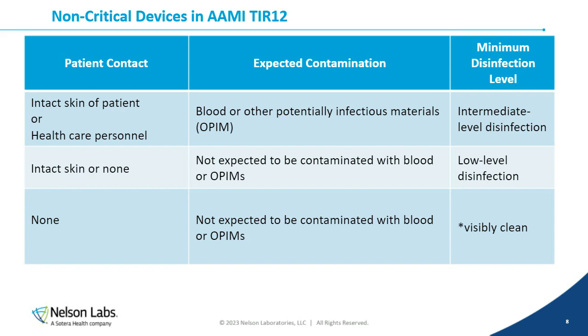That's in line with what it says in that FDA guidance document. However, the conservative approach is just to do a disinfection validation even on those devices that are not likely to see blood or other potential infectious materials, just to minimize that risk of cross-contamination.